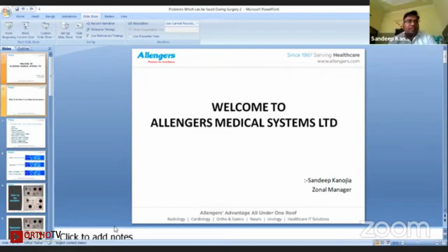One more suggestion, sir, for when the C-arm is not available. Earlier they would go for a mobile X-ray or fixed X-ray, but right now it is the time for a mobile DR. If the problem persists and no emergency support is available, they can go for a mobile DR and complete the surgery. Do we have the mobile DR in the same machine, or do you have to have it in a different setup? How do we look into it?